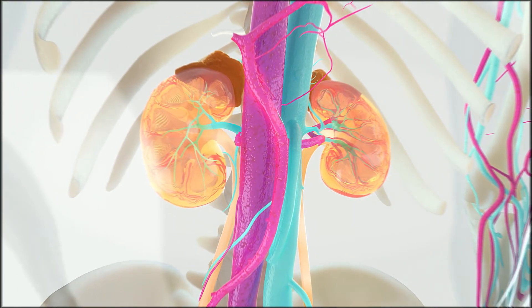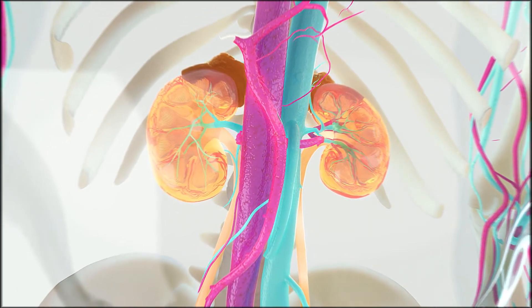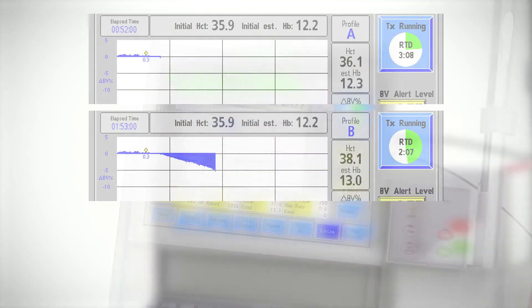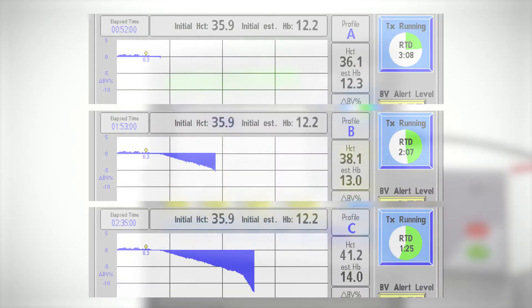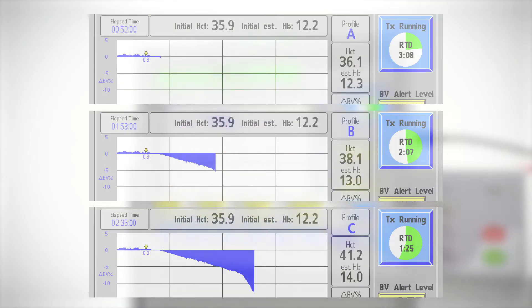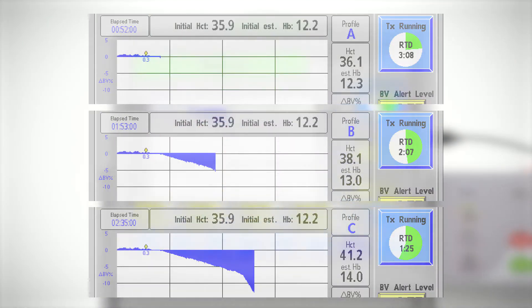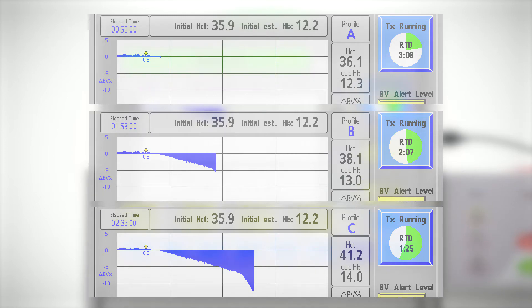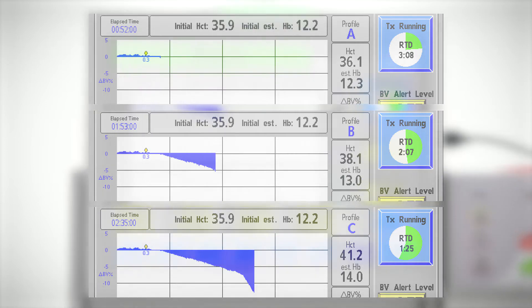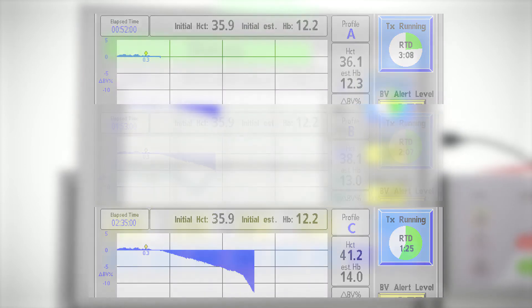Also displayed is the patient's percent change in relative blood volume, represented as profile A, B, or C. These profiles monitor the relationship between the patient's plasma refill rate and the ultrafiltration rate.